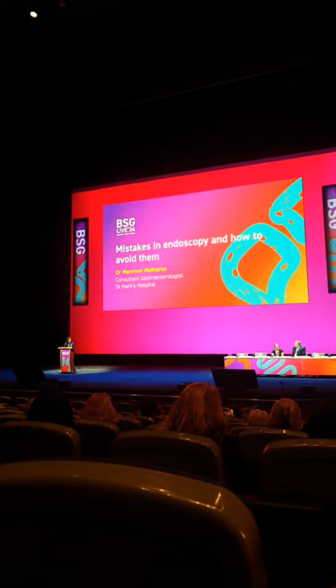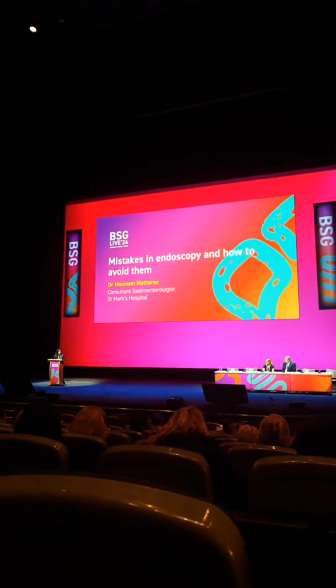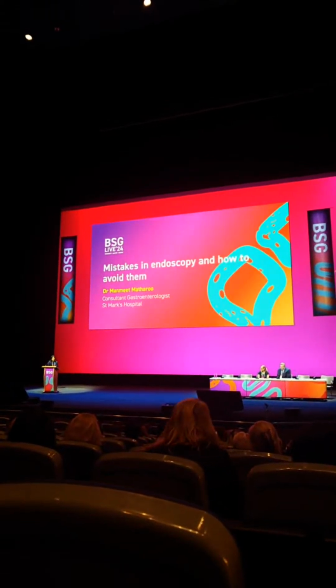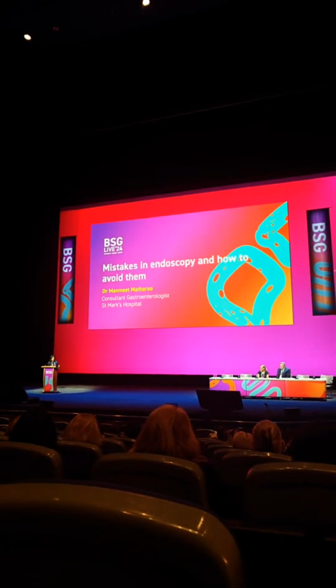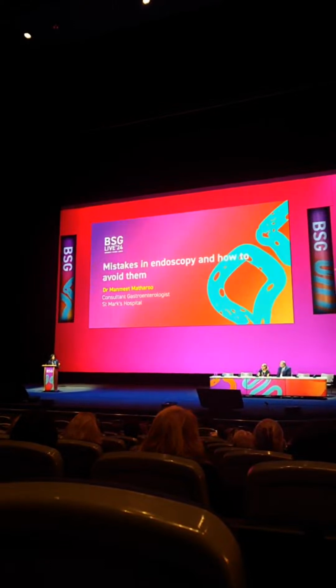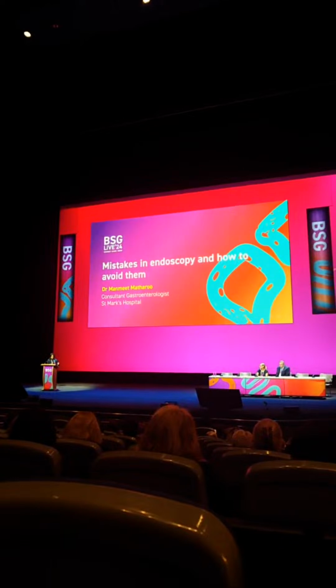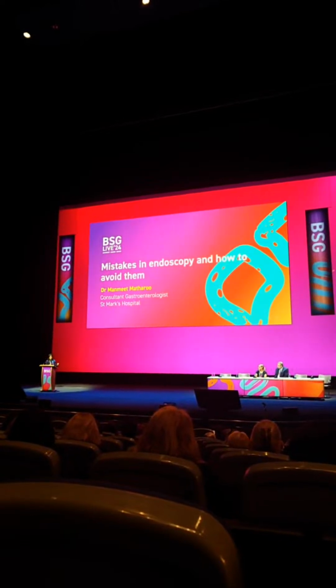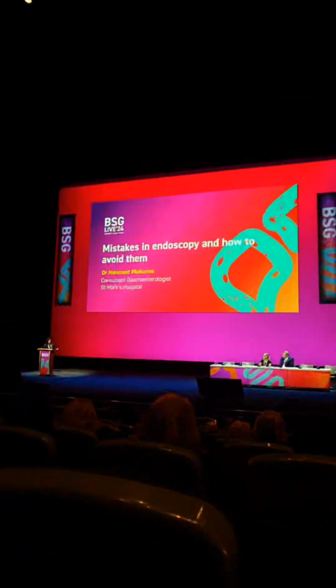Thank you. And if you have had a complication during your list, should that endoscopist do the next case? So I think there's no set rule about this, but I think an acknowledgement that that endoscopist may not want to do that next case or may not be the best person to do that next case, and normalising that is completely important. I think we have a bit of a macho culture still in endoscopy and in surgery. We're doing increasingly therapeutic semi-surgical procedures, but actually recognising that you might not be right to do the next case is totally normal and totally fine.